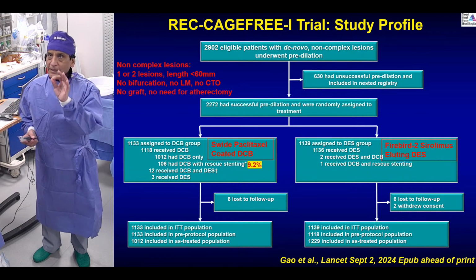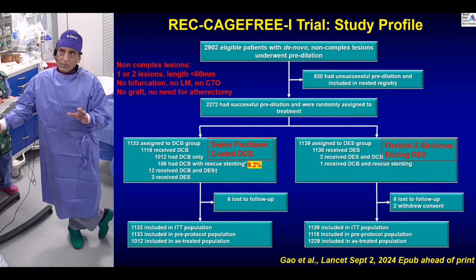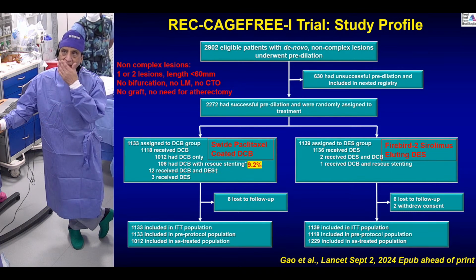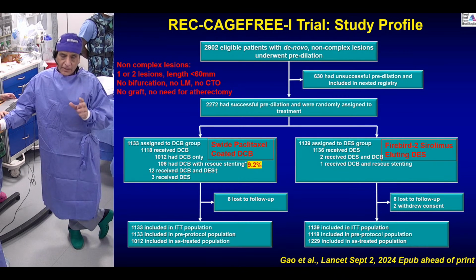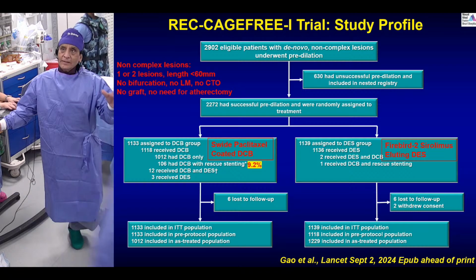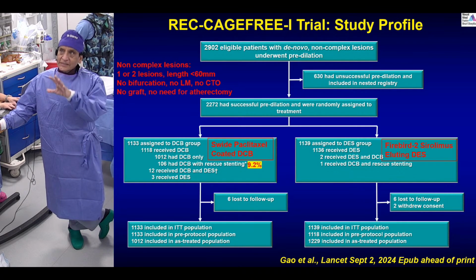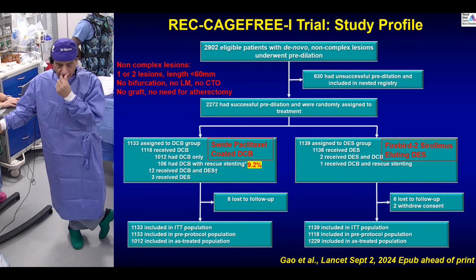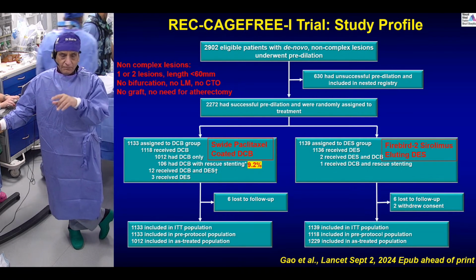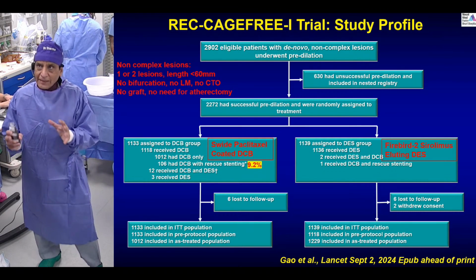Now they use a special drug-coated balloon. This is not our classical drug-coated balloon like Sequent or Agent or the others. It is a Swide paclitaxel-coated drug-coated balloon, although they have shown data that is comparable to Sequent and other published drug-coated balloons. And then the stent is the Firebird 2 sirolimus-eluting DES, again made in China. Both these products are made in China, and Firebird has been compared with other stents in the past.